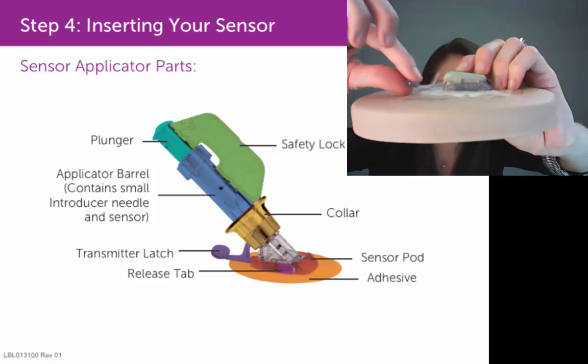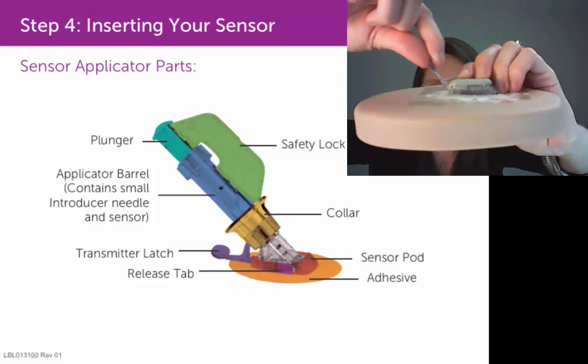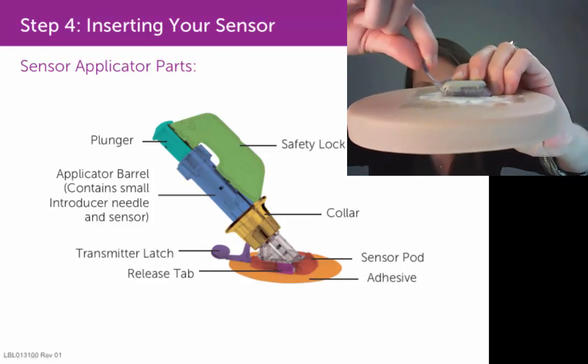Then grab onto this transmitter latch and pull the latch towards the transmitter. Pull it really, really hard until you hear two separate clicks.